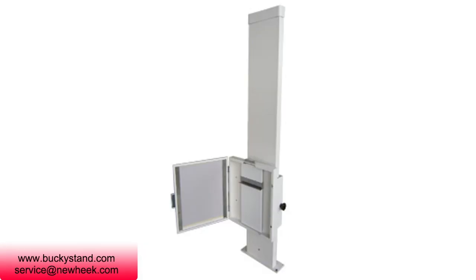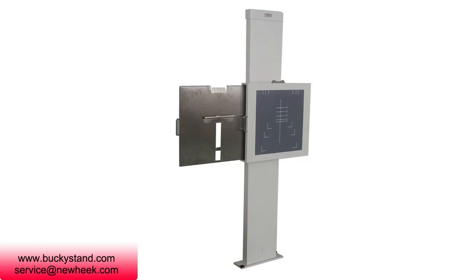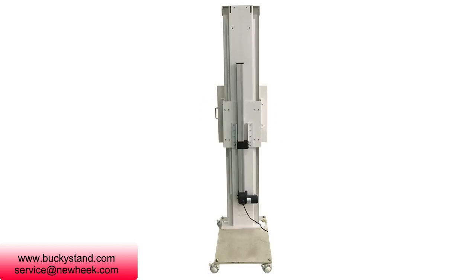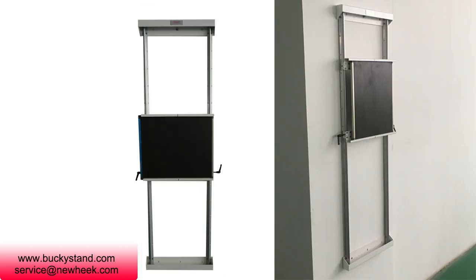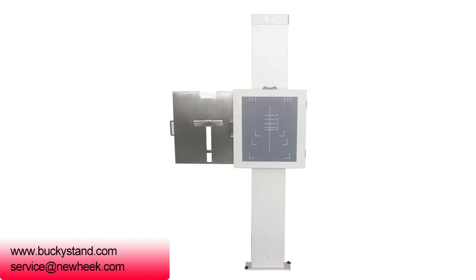Firstly, the fixed grid chest rack is used on various medical diagnostic machines to perform filter photographing on the head, chest, abdomen, pelvic and other parts of the human body. The device can be arbitrarily positioned in the vertical up and down movement range, and is easy to operate, flexible and reliable in film shooting, and has a wide range of uses. The device is composed of a filter grid, a cassette drawer, a column, a trolley frame and the like.